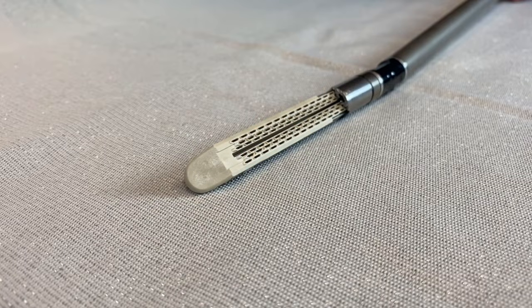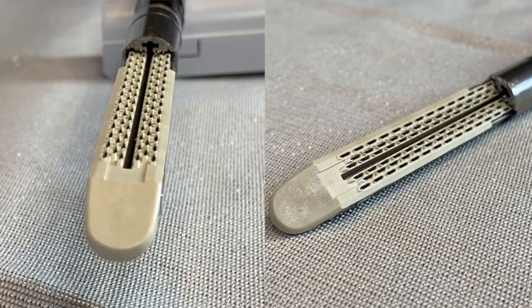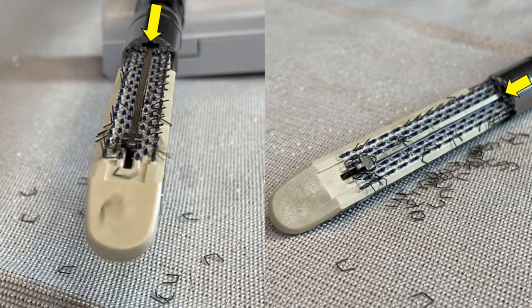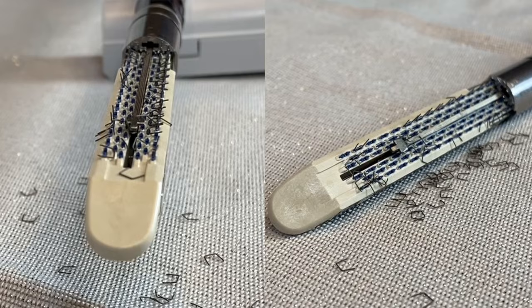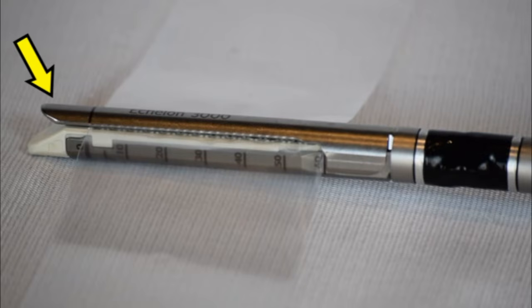Keep in mind that this is a demonstration. This obviously wouldn't happen in real life, but we want to see how this works. So with no anvil, the staples are obviously going to fly all over the place. But in slow motion here, you can see the knife blade following closely behind the staples as they come out. You have to agree, this is some cool engineering. Let's put the anvil back on.